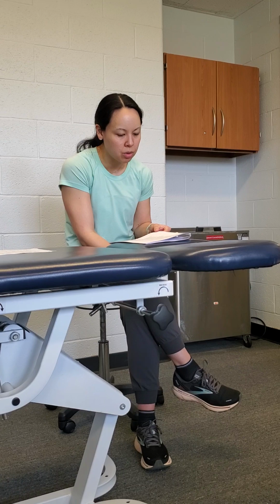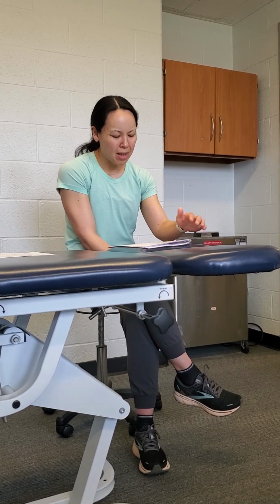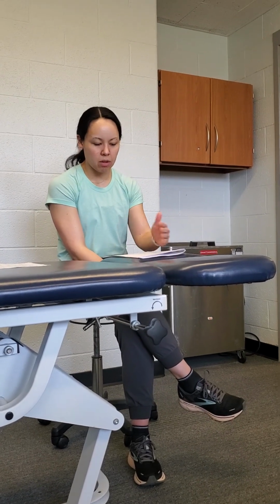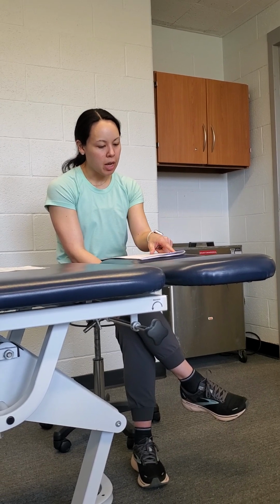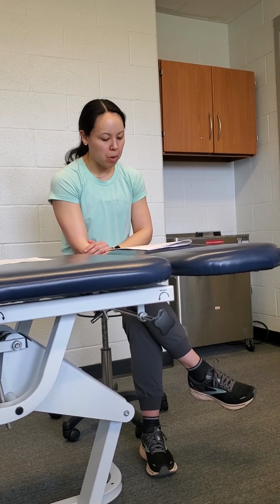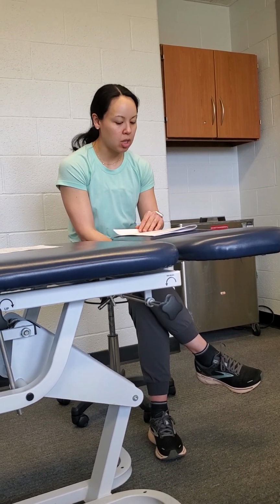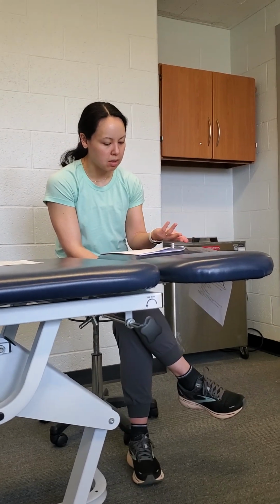Okay, so moving on to the endurance BFR, so aerobic BFR. Again, multiple studies; you guys can look at this. We've already talked about the 3 different settings we would use BFR for. Generally, the goal is to have them do it 3 times a week, for 6 to 8 weeks. This study shows 8 weeks is probably as long as you'll need to use it before they'll be able to transition off the BFR and do the conditioning on their own. There are the parameters again; this is kind of redundant.